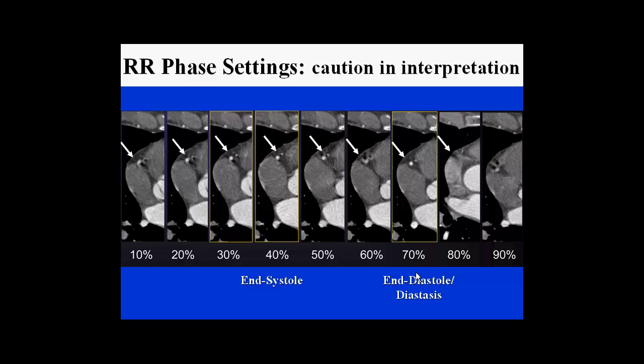Again, the fundamental importance is presenting the phase. I call this a beauty contest. If you're going to determine the best looking picture, you should have other images to review in order to determine that that particular image that you have in front of you actually represents the least motion within any particular imaging set.